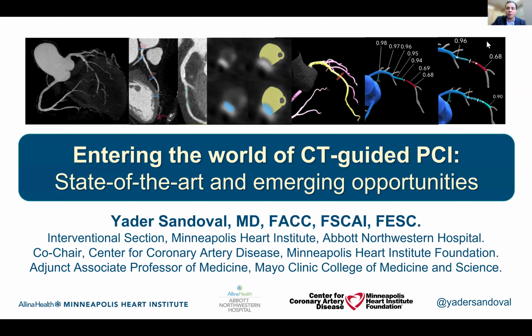As we transition now to PCI procedural planning, I really want to echo something that he mentioned, which is a program. The latter part of this webinar presentation will focus on planning, but I and our team cannot do this whole PCI planning that I'll be showing over the next minutes unless you have high quality image acquisition.